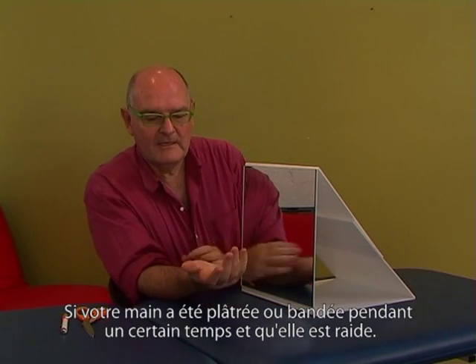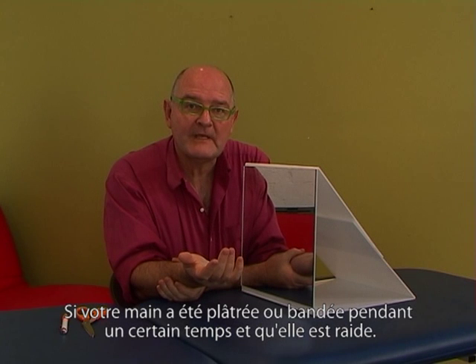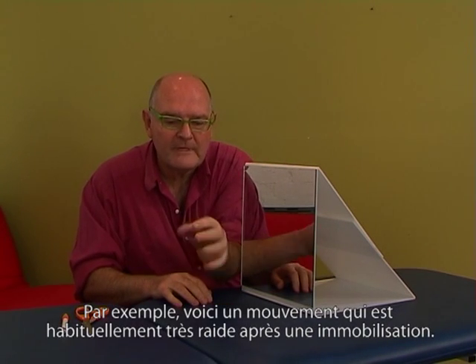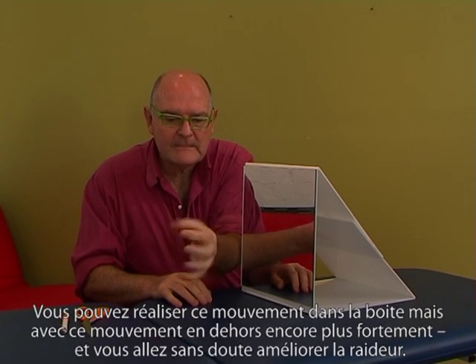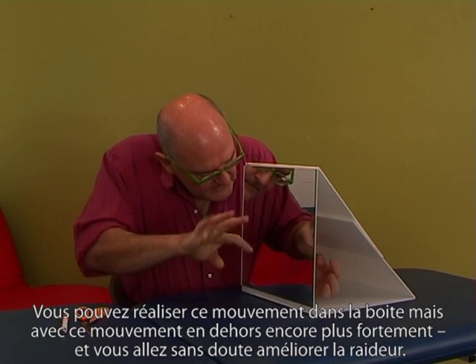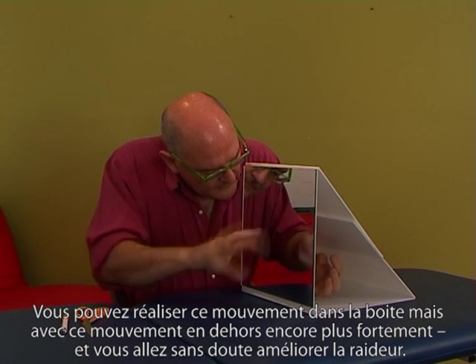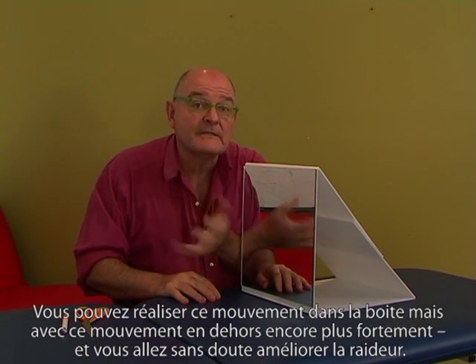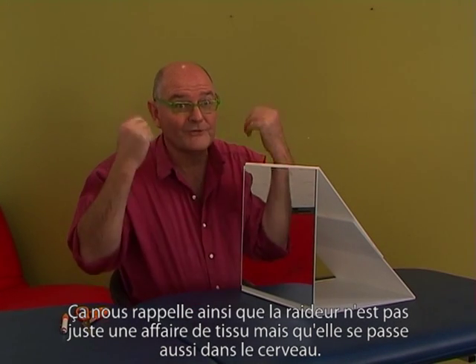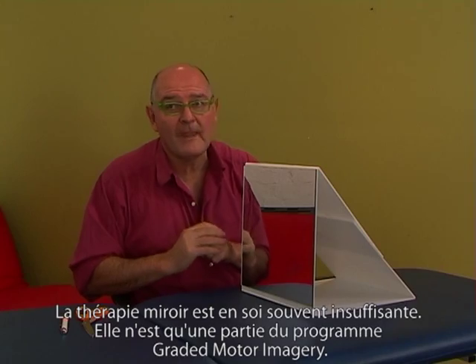If you've had your hand in a plaster cast or a bandage for some time and it's stiff, for example, this is a very common stiff movement after it's been immobilized. You could do this movement in the box, but with this movement, do it even more. And you'll usually help some of the stiffness. It kind of tells us that stiffness is not just in the tissues, it's also in the brain as well.